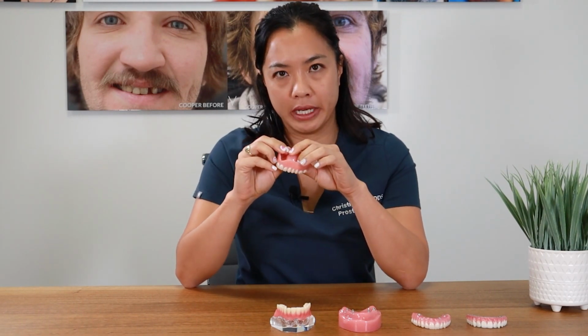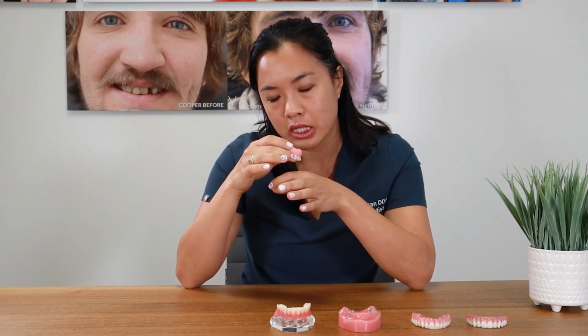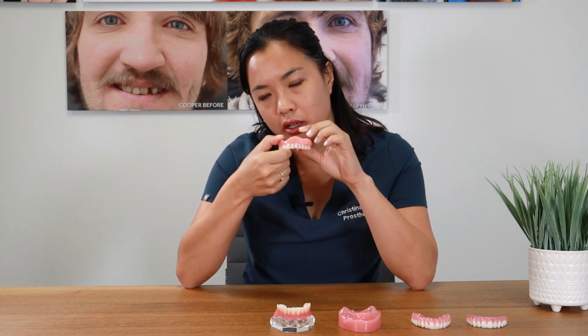So that means when you bite, you're putting all of the force on your gums. Studies show that with a denture, you have only 1/6 of the bite force of when you had teeth. 1/6 is about 16%, so you have a very significant decrease in bite force. With a complete set of dentures, you can see it's one set kind of floating on the gums, and so you can't actually bite with the front. If you bite on the front, it'll cause the back to dislodge.